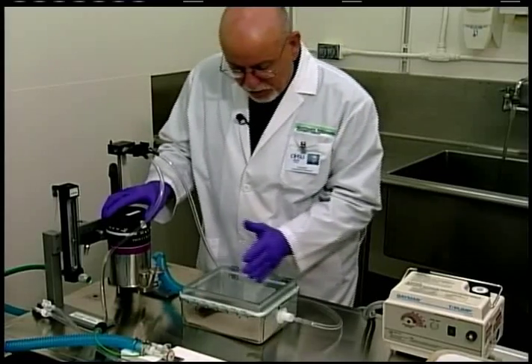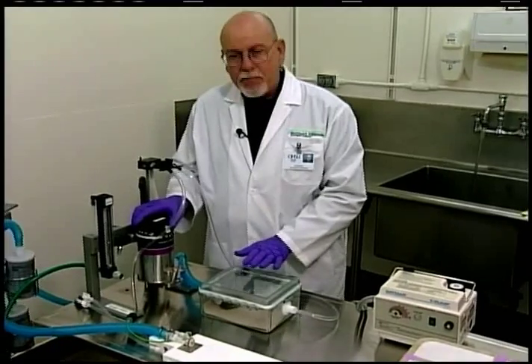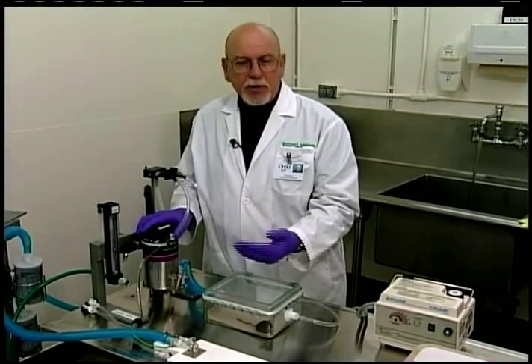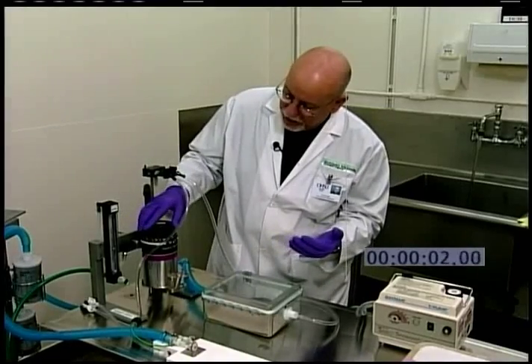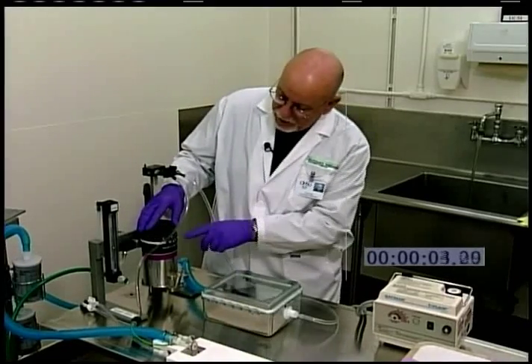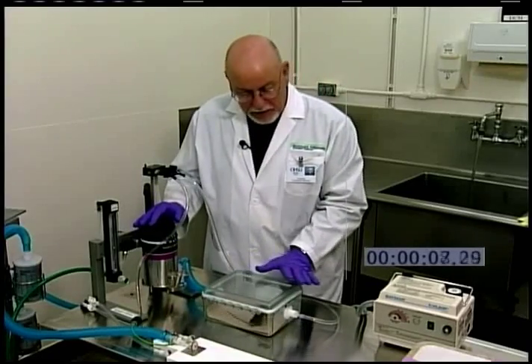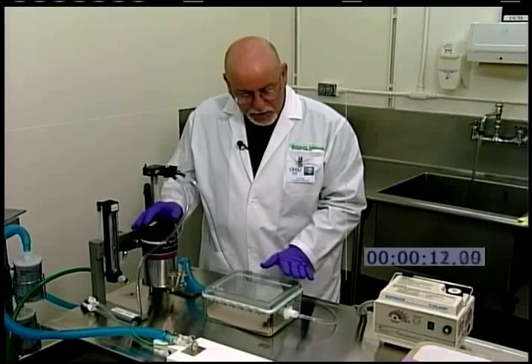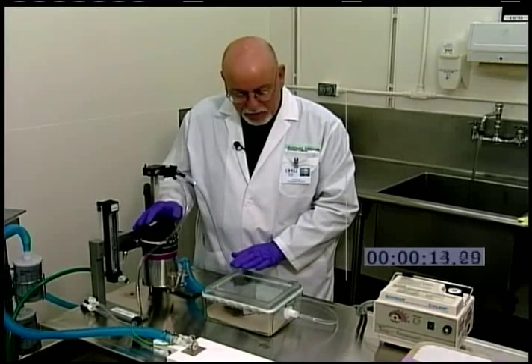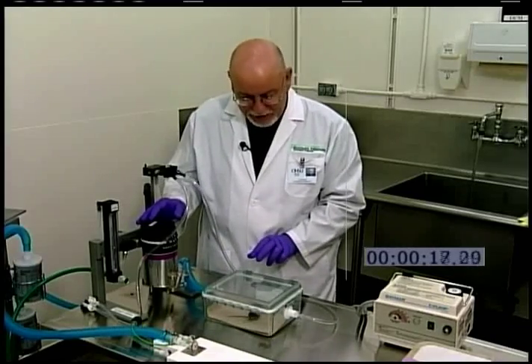Because we have 100% oxygen in here, it's going to take a while to equilibrate this chamber if we just administer 2% concentration. So initially, for about the first minute, what we're going to do is administer approximately 3.5 or 4% concentration. That will help to equilibrate this chamber quicker, and we can watch the physiological signs of the animal to see how he's doing and how he's reacting to the inhalant anesthetic.